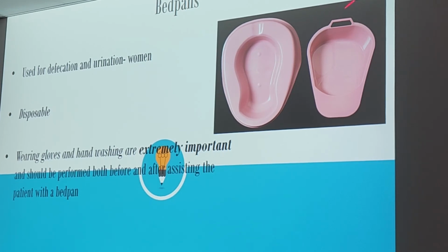The fracture pan is more shallow and kind of contoured better, so it's easy to slide under the patient. This regular one is about 2 inches tall. This one is not as much. This is the fracture pan. This is a regular bedpan. It's only 2 inches.